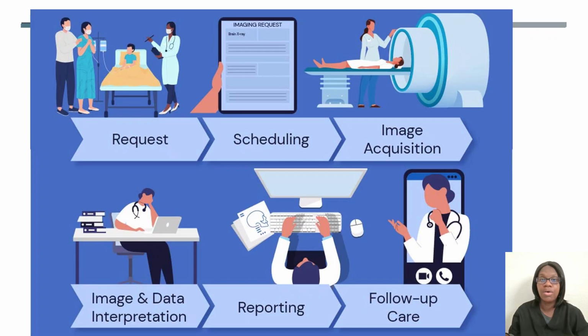And we also have our radiology workflow. A doctor puts in a request for a scan, and then it gets scheduled, and then we do the images, and then after the images, it goes for image and data interpretation. Afterwards, you have your reporting where the report is generated, then it gets sent to the doctor's office for follow-up care if the patient needs it, and of course, the doctor will relay the information to the patient.